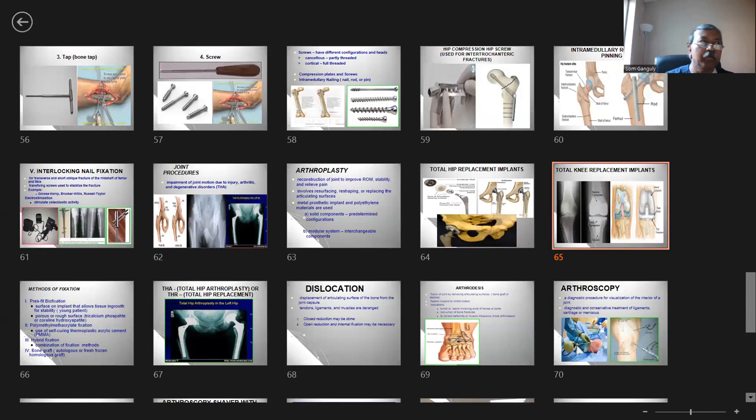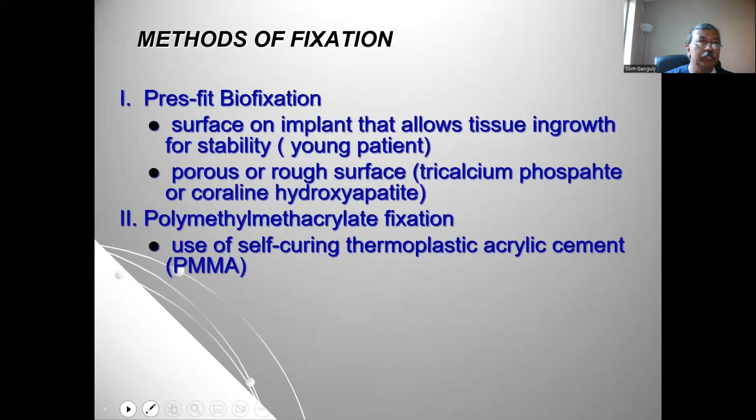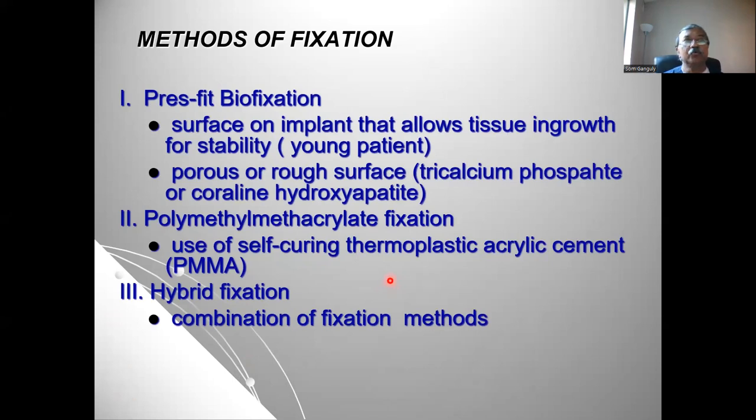Now, as you can see, the reconstructed hip or knee or shoulder could be of two types. One is without cement, or non-cemented, we call it press fit, biofixation, or just press fit, where the surface of the implant grows tissue inside through that implant, allowing tissue to grow through that and maintain a strong, solid stability.